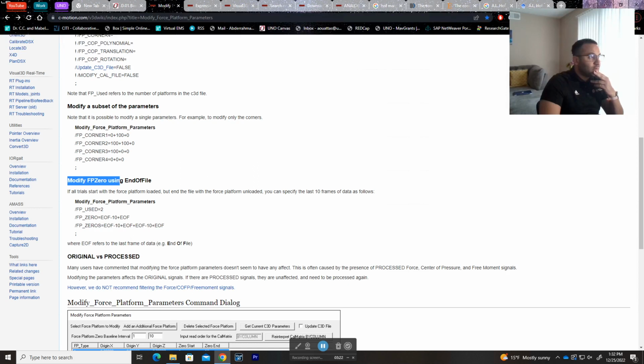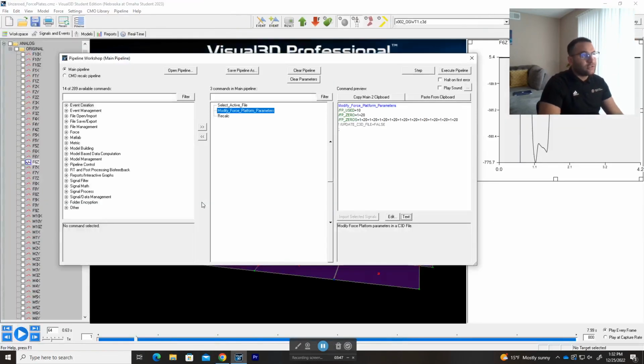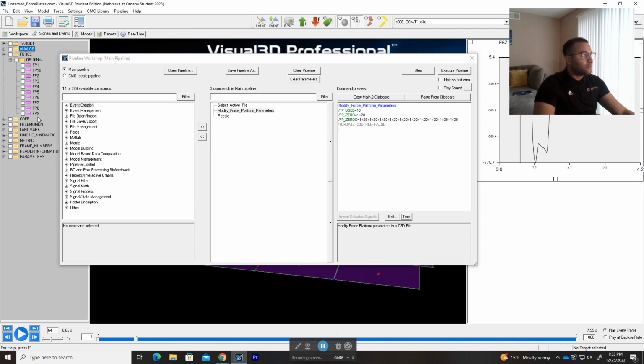So in here we'll use modify force platform parameters, and we'll use the specific format here. We'll use FP zero to basically make sure that we're given the code certain frames. So here 10 is going to be 10 frames. What we're going to use is 20 frames actually. FP used is the number of force plates that you're collecting with. We have 10 force plates in the main gait lab, so you add 10, and it just depends on how many force plates you have in your actual data. So if you have 6, for example, you just put 6, but we have 10, so I'm gonna add 10.